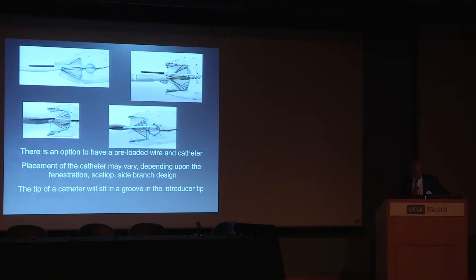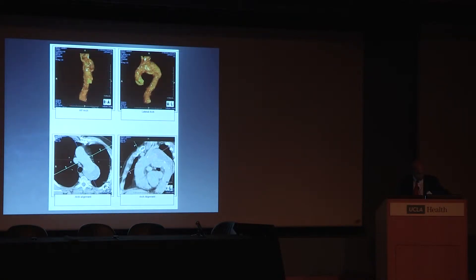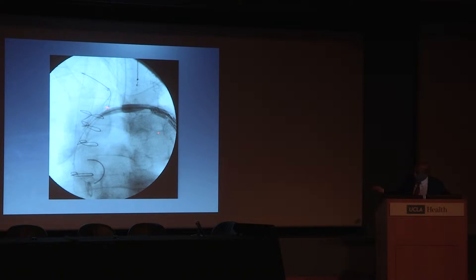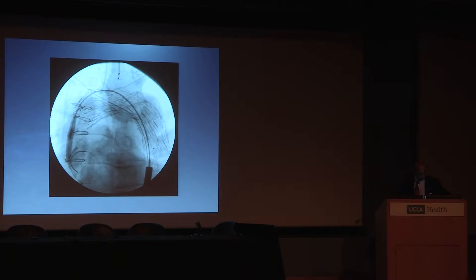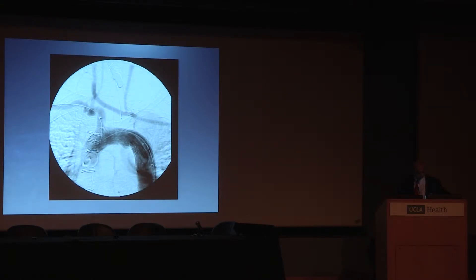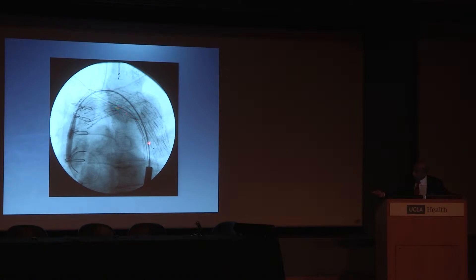We had pretty good success in the abdominal aorta with endovascular fenestrated grafts, as seen with Brian's talk. We thought: why not use this in the arch, using scallops for the innominate artery combined with fenestrations for the carotid artery with the preloaded catheter technique? The preloaded catheter works by sending a wire through it from the right arm, snaring that wire, and while two people hold either end during stent graft deployment, the preloaded wire keeps that fenestration or scallop in line with the target artery. In this particular case a debranching procedure was still needed because the patient only had a scallop for the innominate.